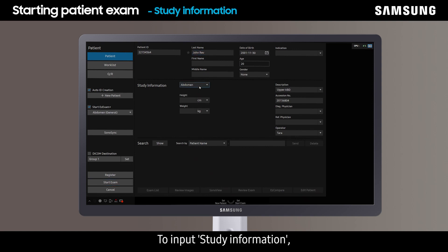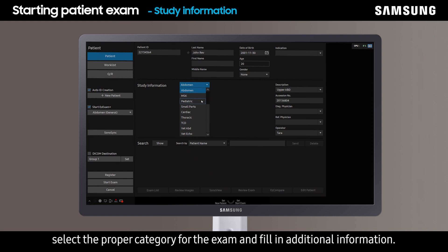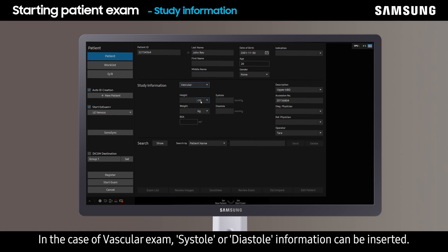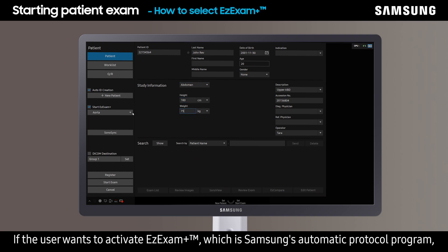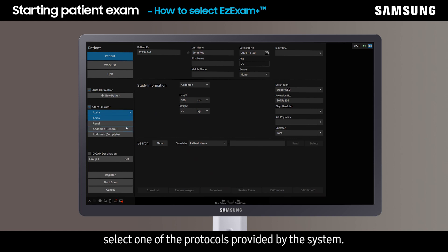To input study information, select the proper category for the exam and fill in additional information. In the case of a vascular exam, systole or diastole information can be inserted. For abdomen exam, the user can enter height and weight. If the user wants to activate Easy Exam Plus, which is Samsung's automatic protocol program, select one of the protocols provided by the system.